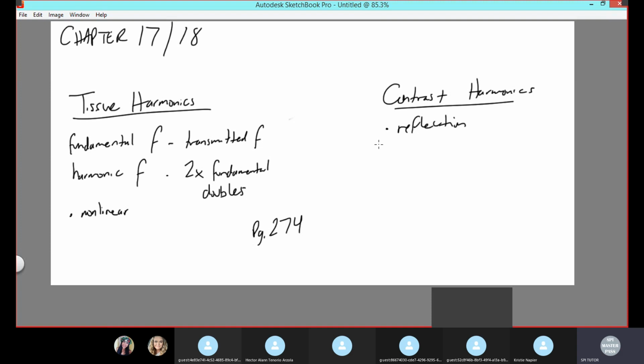So it's easier for me to think of it that way because I know that I'm scanning a 400-pound guy, using both my hands just to try to see, a little shaky here, so I can know the heart is at least there. And I'm just waiting for the moment I put in those contrast so that the heart can just look a lot nicer. It really just makes a big difference. So that's the way that I try to remember that. Tissues being transmission and contrast just makes my image a lot prettier.